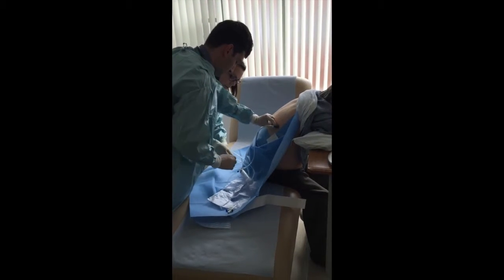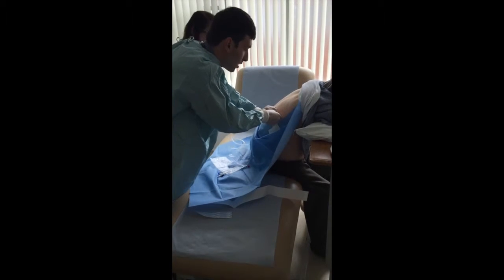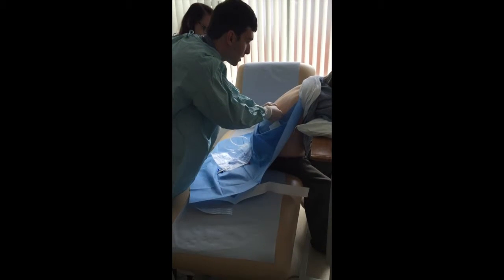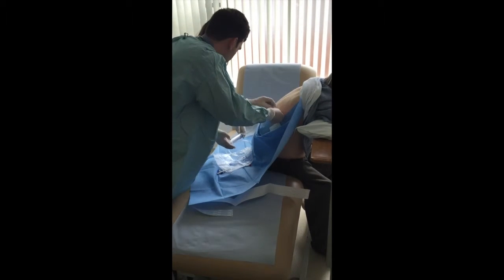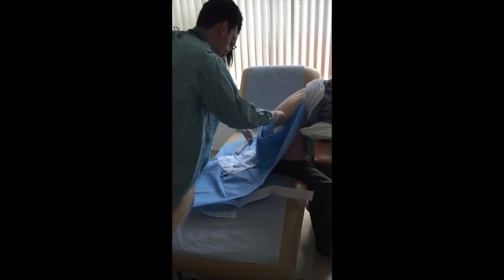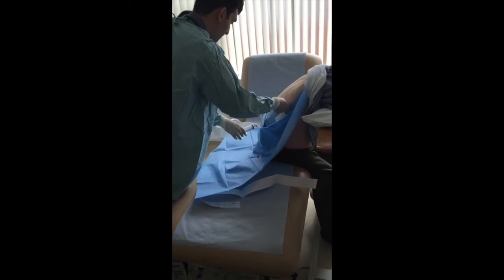And at that point, what you're going to do is just get the patient to take a big cough. Okay, big cough. Fluid now. Big cough. Okay, and again. And as soon as your fluid gets to about the three-way tap on this, so another couple of coughs for me, sir. That's great. Then that'll start flowing.